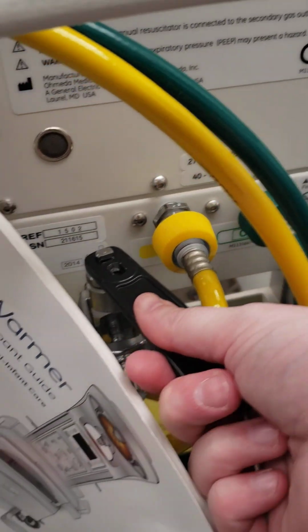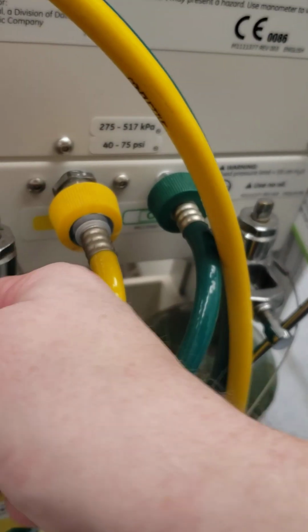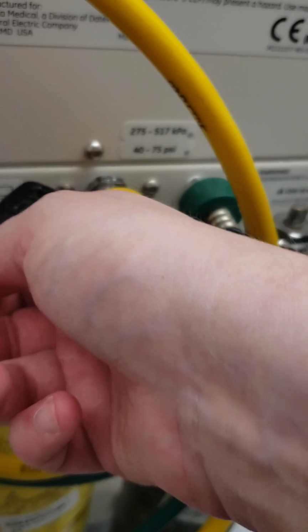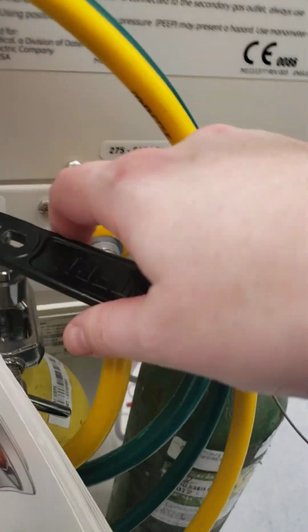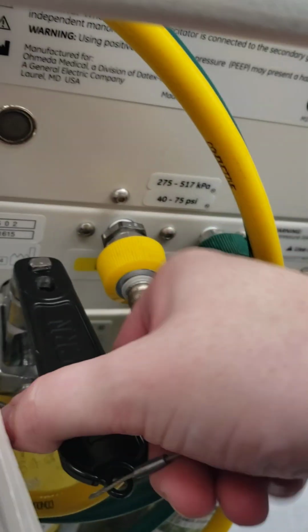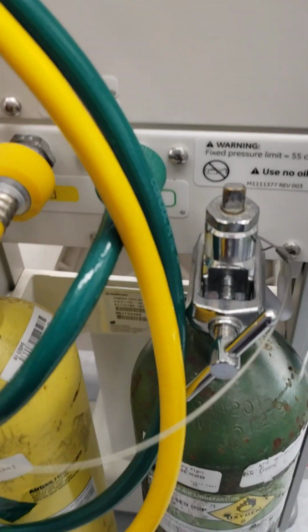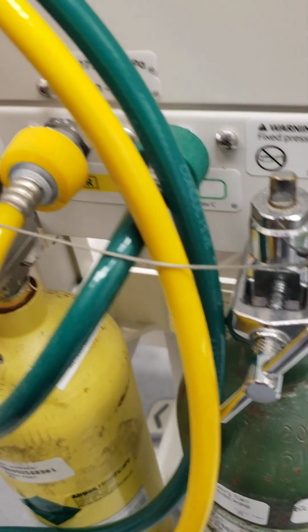And the medical air. The purpose of the medical air, in addition to the oxygen, is so that way you can give your baby the appropriate concentration of oxygen and whatnot during resuscitation, as guided by the NRP stuff. And it can be a little tricky, so.